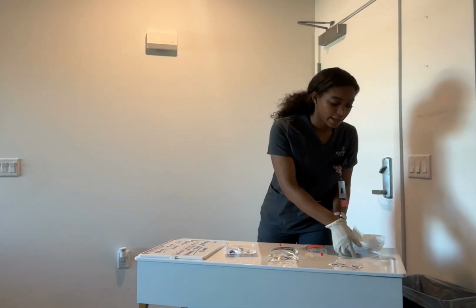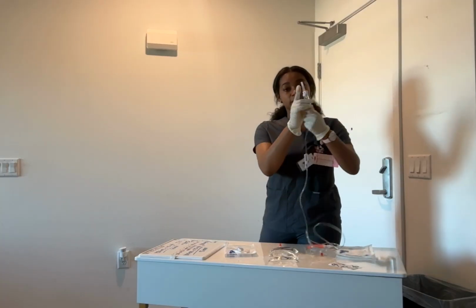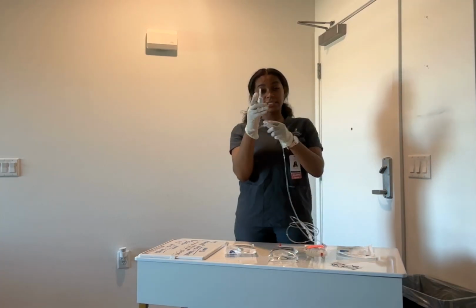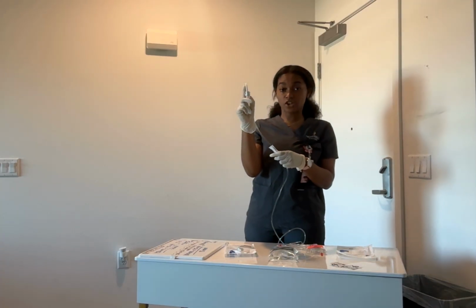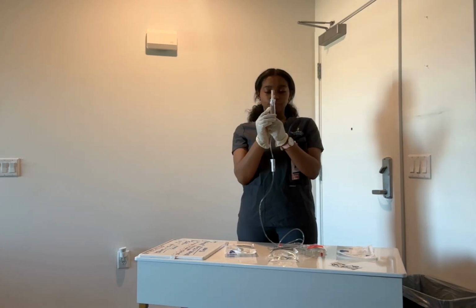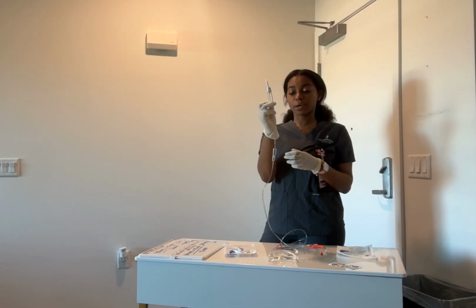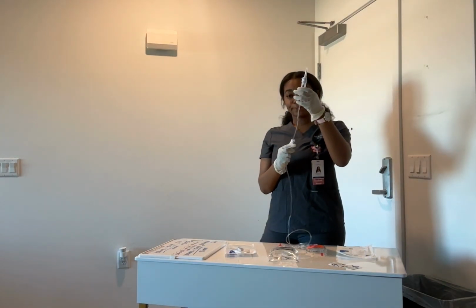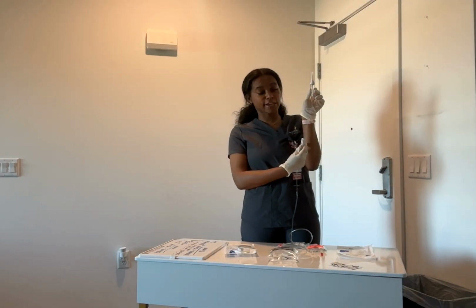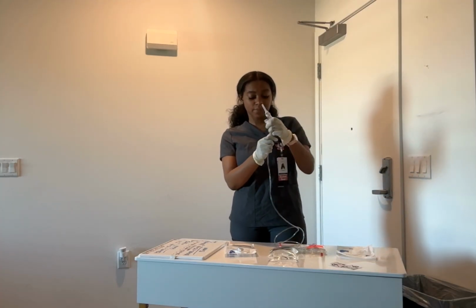Okay, and I'm going to explain the IV administration set. So the tip here, this should remain sterile. This is the spike, so this is going to go into the medication. And then we have our drip chamber. We're going to be able to see our flow rate in here and make sure that there's no air bubbles. And then we have our roller clamp. And this, we're going to be able to adjust and control the flow rate by stopping it or slowing it down or speeding it up.